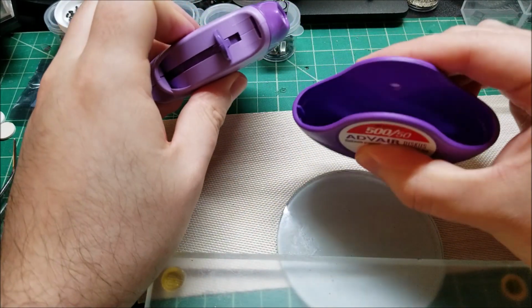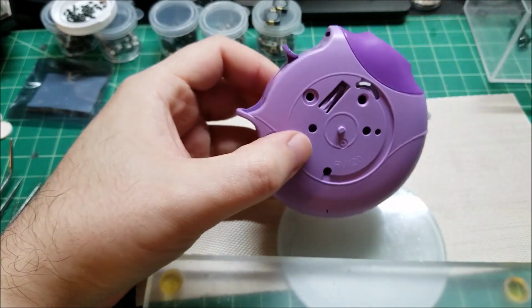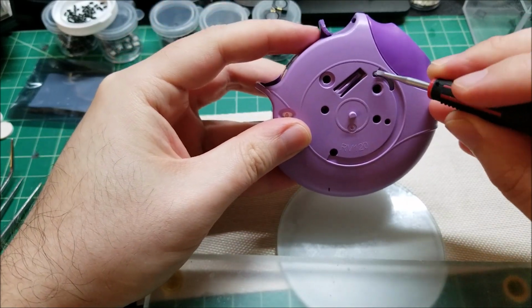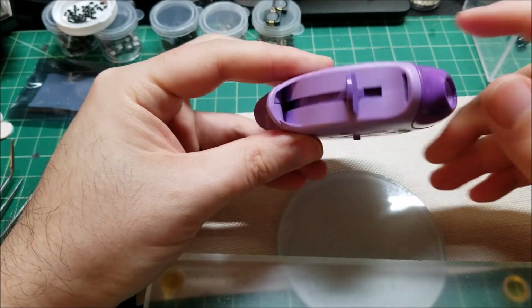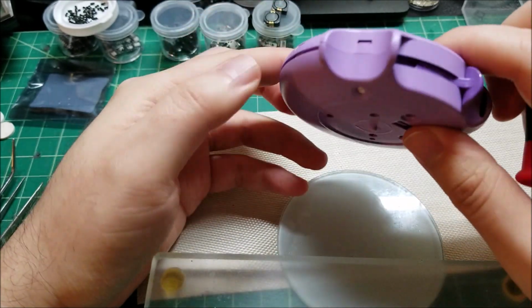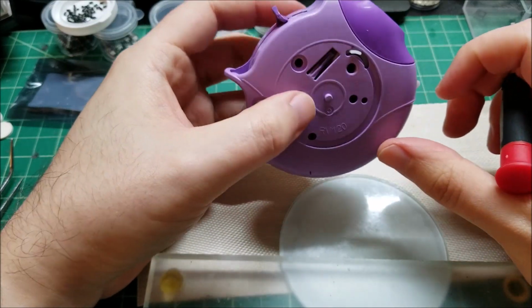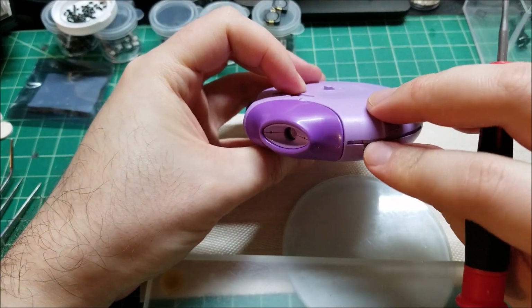The shell, there's really nothing special about it, but all the goodies are inside here. Now you can see the mechanism that's attached to this little handle moves something on the inside, like a crescent-shaped thing. There's something applying downwards pressure here, like a little plastic spring. On the other side, not really much besides these little detent thingies. Like I said, you can see these 2 pegs, and they have little slopes on them so that you can insert it into the case, and during assembly it'll click back in. There's a little piece of plastic here.